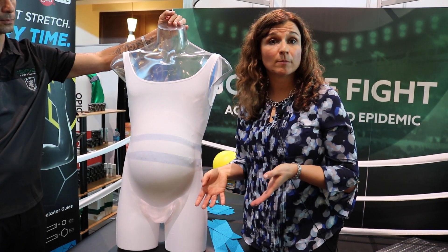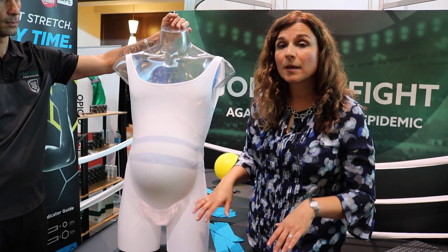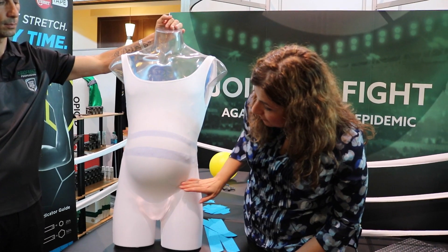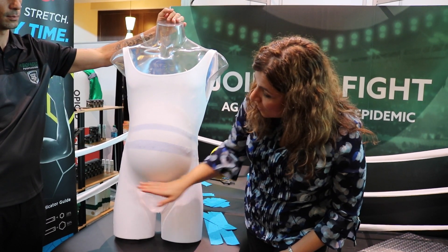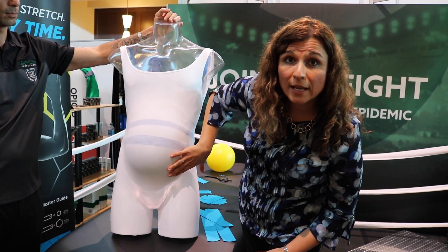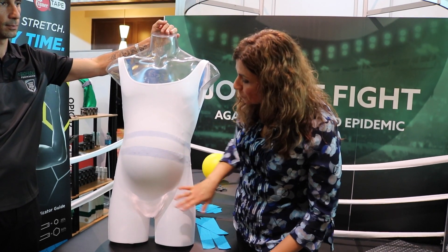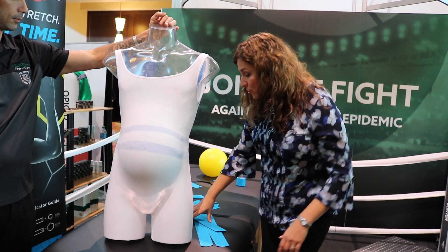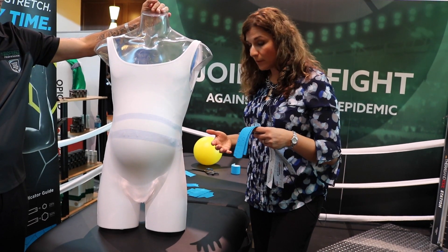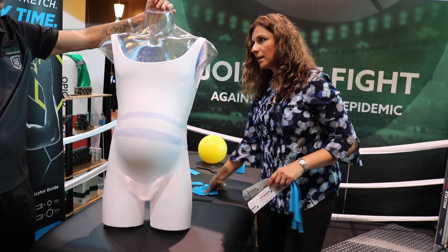Usually what I will do is have mom locate the pubic symphysis — I'll tell her to find that bony shelf underneath her abdomen and place her hands there. If the patient has shorts or pants on, I actually have mom place her hand down and push the tape onto the pubic symphysis so that I'm not entering an area they may be uncomfortable with. Traditionally, I lay the patient down to take some pressure off the pubic symphysis as they lie posteriorly.